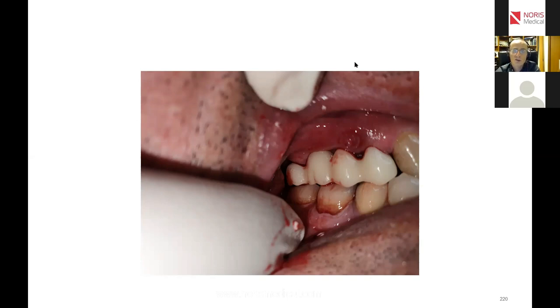Dr. Vishal Panjwani asks me, is it always necessary to place a pterygoid implant when we replace 24, 25, 26, 27 tooth areas? If we want to avoid the sinus, or if we are not sure enough, I think that a pterygoid implant can give us extra security. Now, note, doctor, that it is actually very easy to put the pterygoid implants. It's a technique that, although the implant is very long, is very, very easy to master.